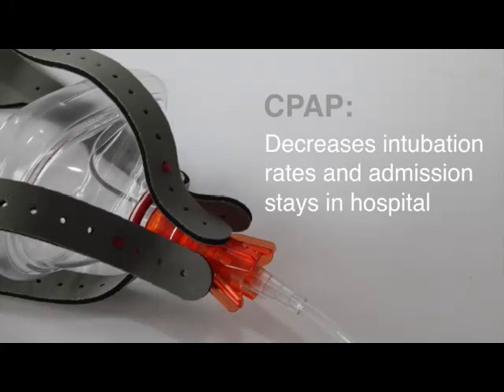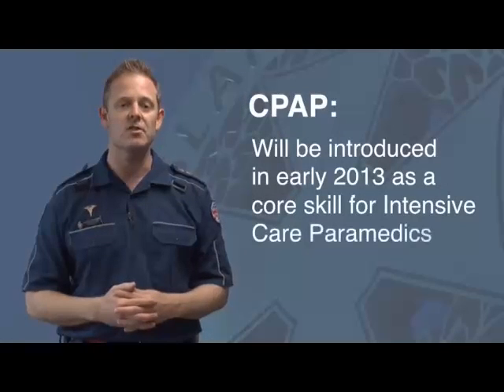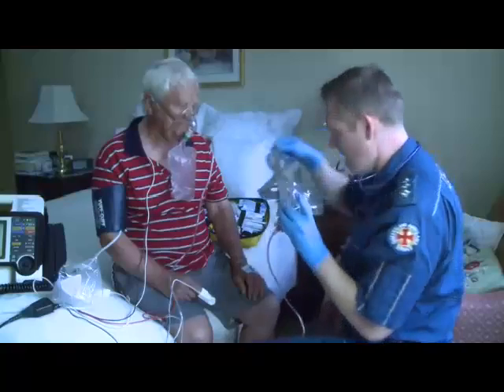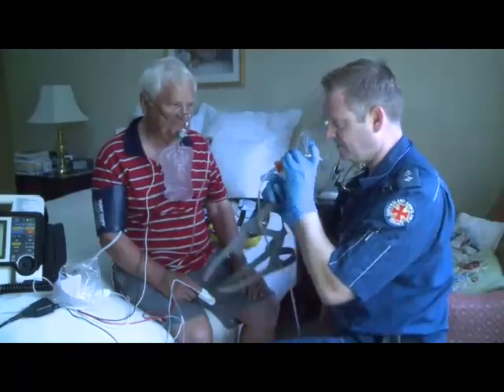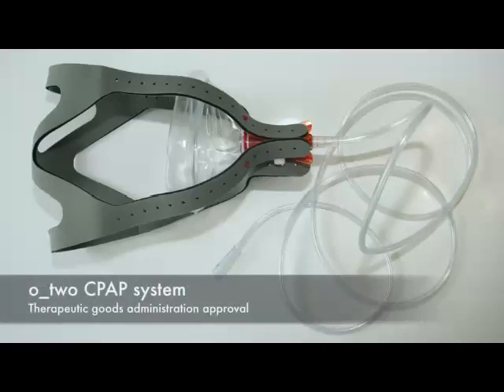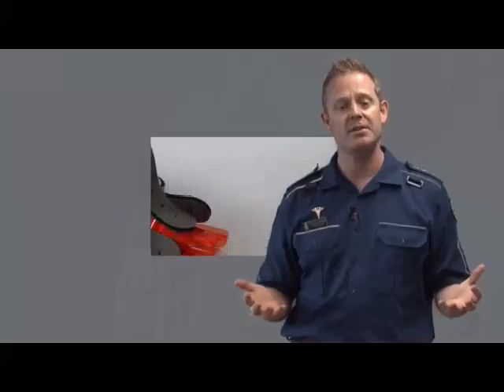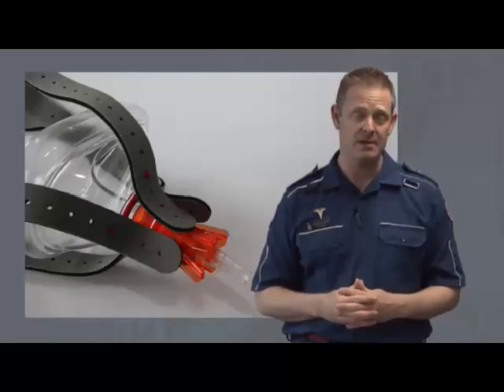The QIS is proud to announce that CPAP will be introduced in early 2013 as a core skill for intensive care paramedics. The O2 closed CPAP system is a new product in Australia that has recently received Therapeutic Goods Administration approval, and has several favourable features when compared to other products currently used in the pre-hospital environment.